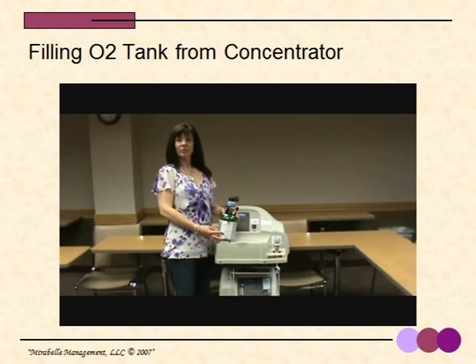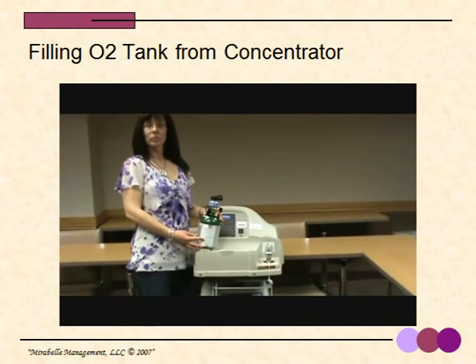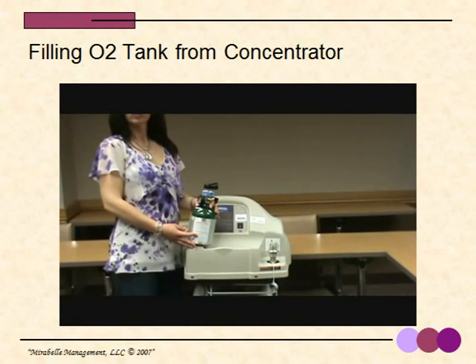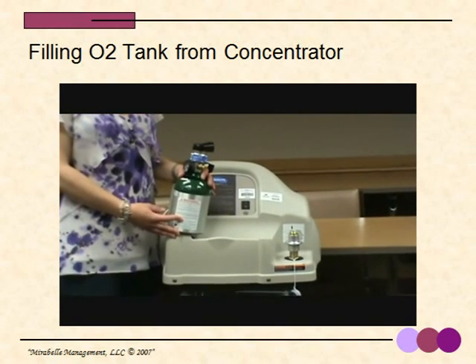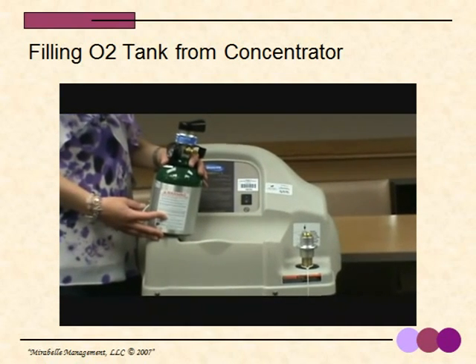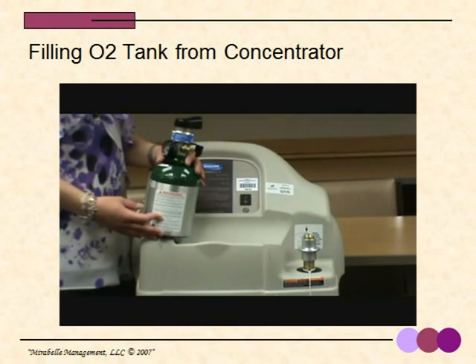Before we show you how to fill a portable tank from a concentrator, I want to remind you of a few of the safety precautions when using oxygen. You'd need to wash your hands before handling equipment. I don't think it's necessary to use gloves. Remember, there's no smoking within 6 feet of oxygen. That would be important when you're away from the building and you might not realize that it's a no smoking area. There is no use of combustibles or electrical appliances or equipment in an oxygen environment.